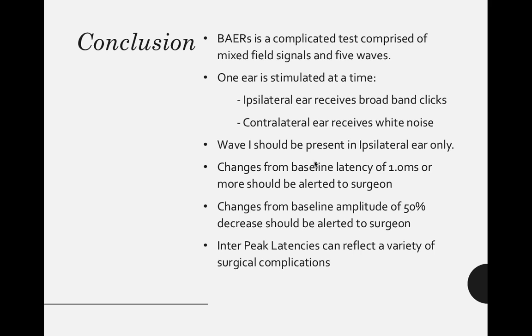And this variety, this complicated nature of these tests, is why ABRs are used so heavily in the clinical setting and with professional testing. There's a lot of information that can be drawn from ABRs, and the test makers will use this complicated nature of the test to see how well you can think around problems.